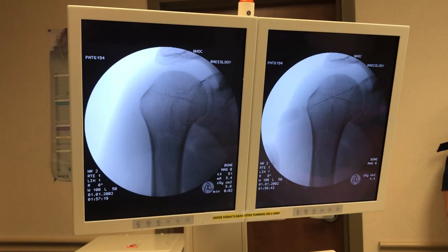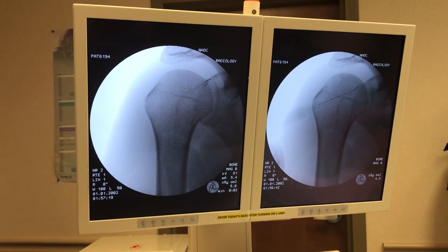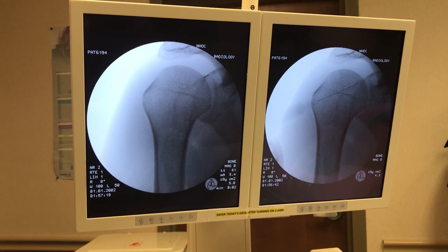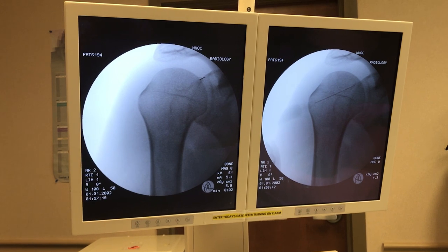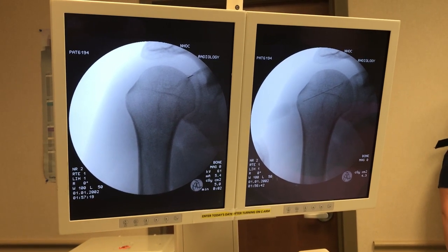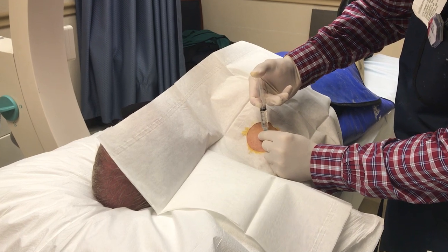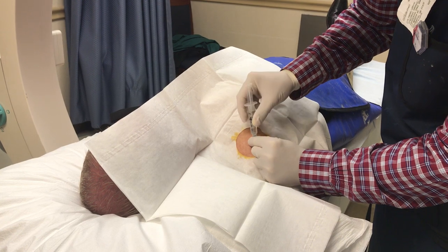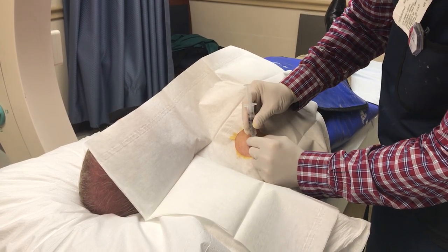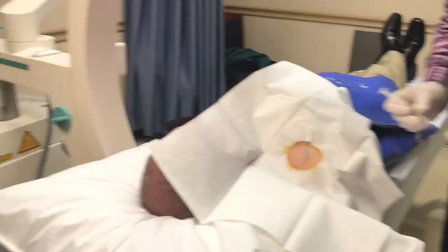I'm going to move just lateral there with my needle. I'll get a better feel if I'm in the shoulder joint by just touching the humeral head there. I'll inject a little lidocaine and make sure I have good flow without resistance. No real resistance there, so we'll take another X-ray to see where we're at.